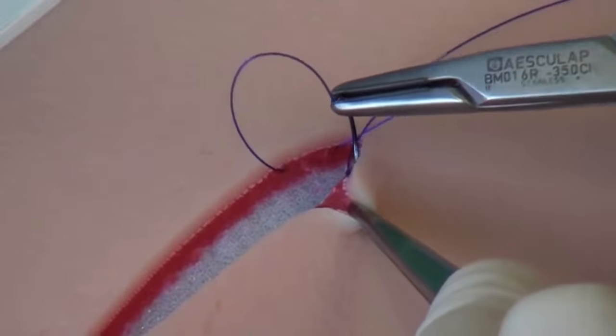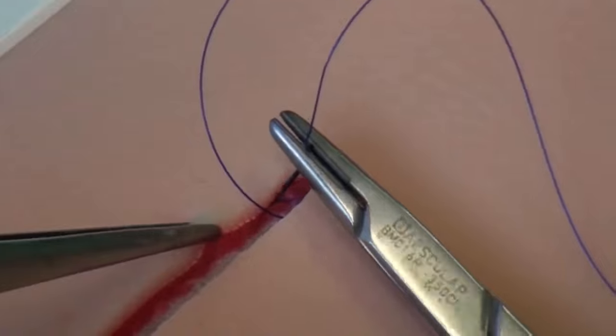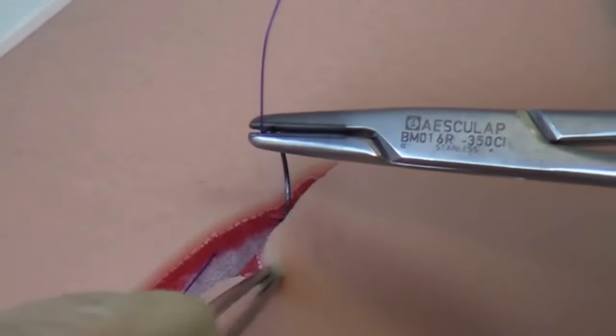The needle is led parallel to the wound gap. The insertion of the needle on the opposite side is made approximately at the level of the previous exit point, so that the thread runs slightly diagonally towards the wound gap when changing to the other side. Therefore, the overall suture is serpentine or meander-shaped.